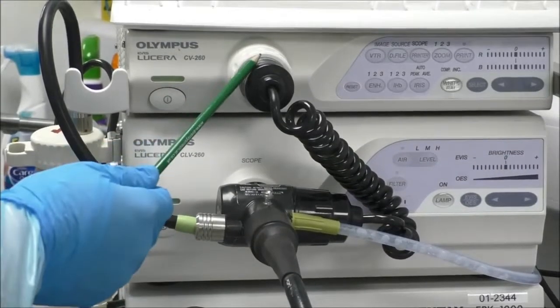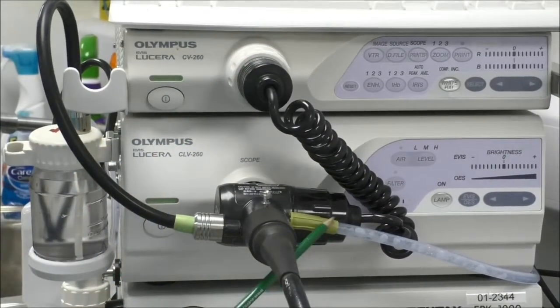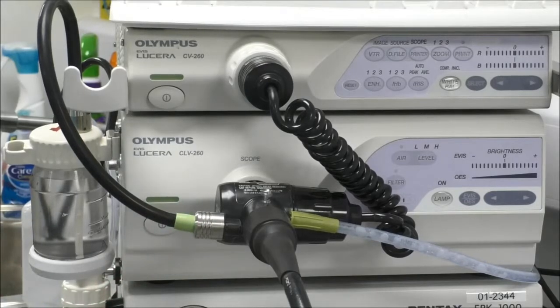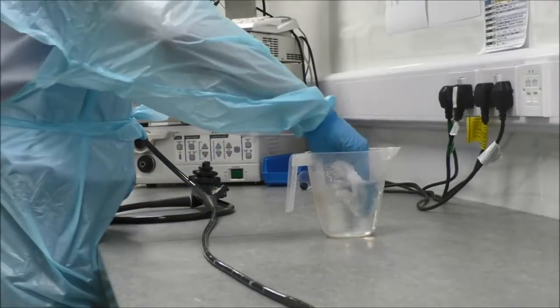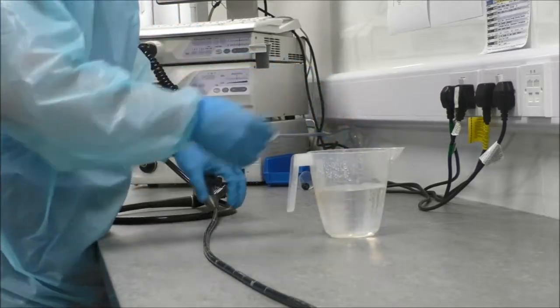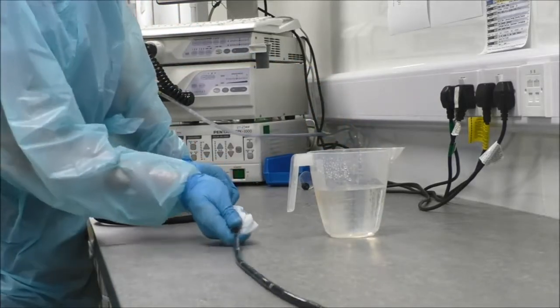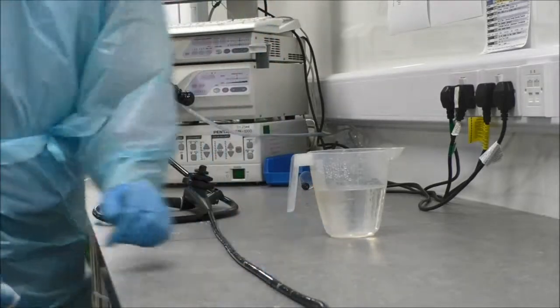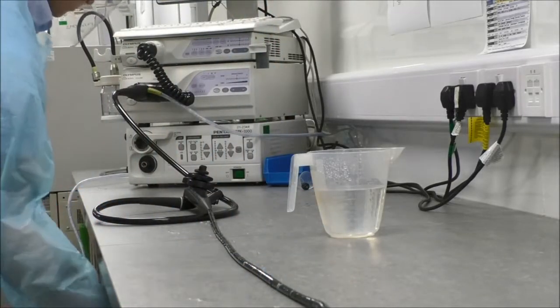Ensure the endoscope remains connected to the electrical connector, the suction connector, and the air water bottle. The first step at the patient bedside is to take a lint-free cloth in detergent mixed solution and wipe the insertion tube from control body to distal end, paying particular attention to the distal tip.